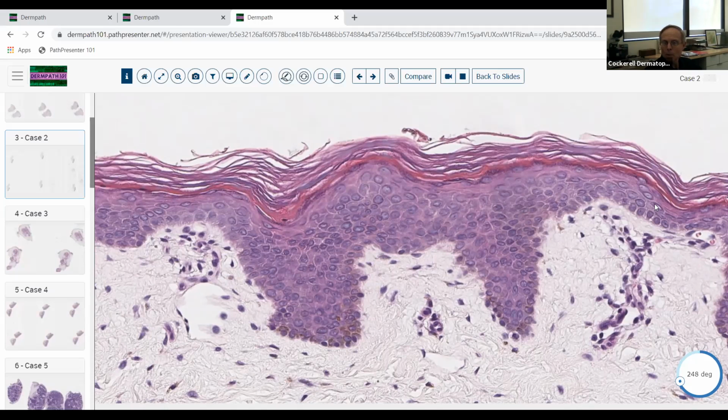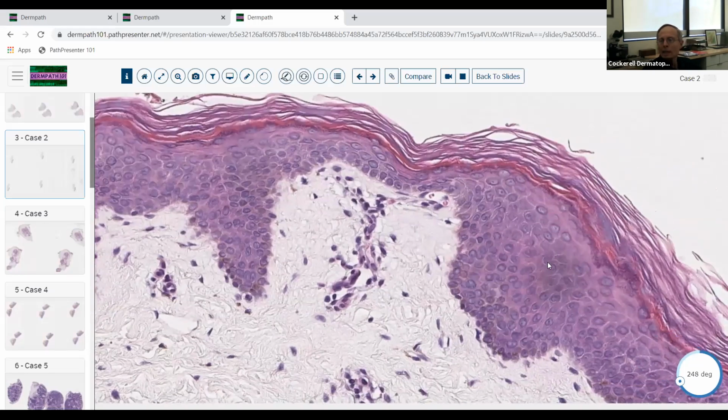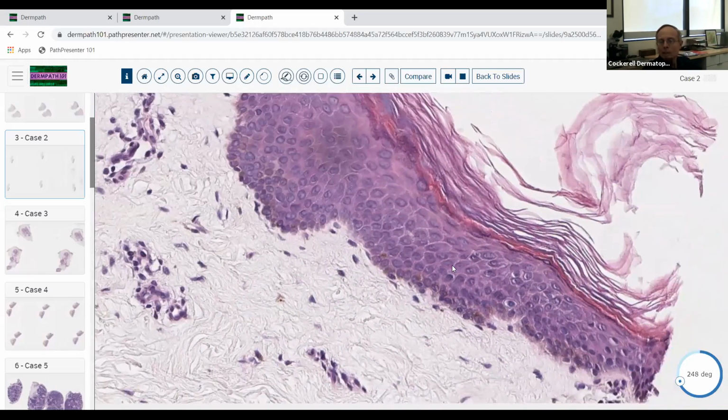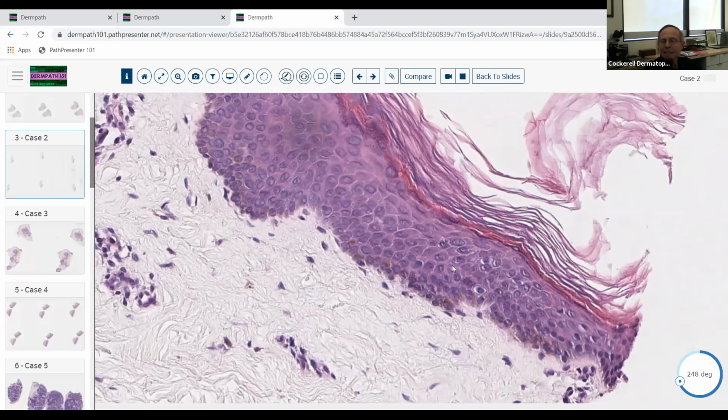It really looks almost like normal skin with maybe a little bit of lichen simplex chronicus and a little bit of spongiosis. Sometimes you get a little bit more spongiosis than you see here. You will never see true spongiotic microvesicles. You can see a little bit of spongiosis, and sometimes a little bit of parakeratosis with a little bit of crusting. But this is one that does not show pathognomonic findings. It just basically shows what you would see in an example of asteatotic dermatitis.